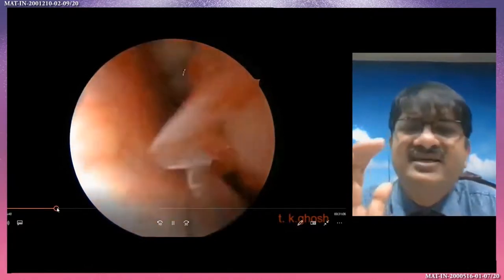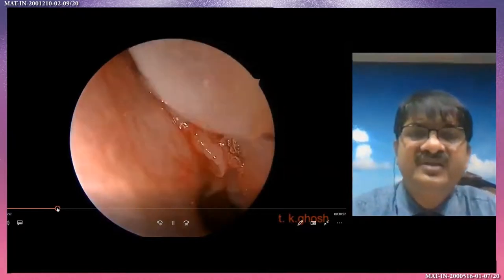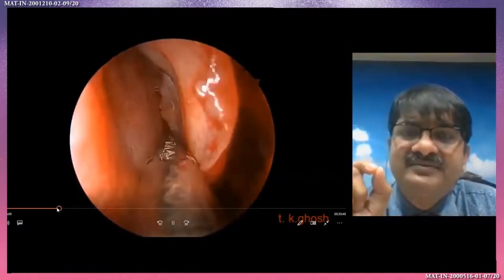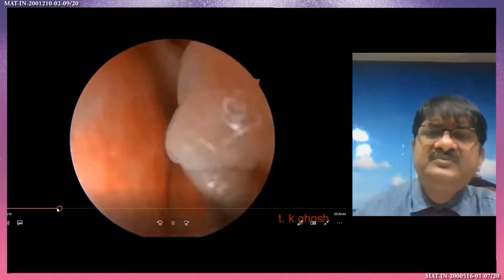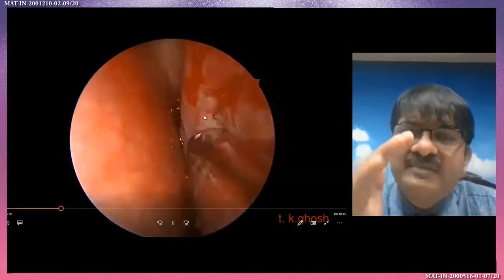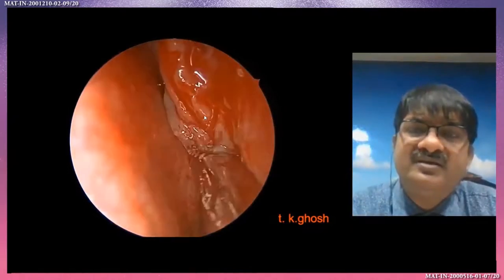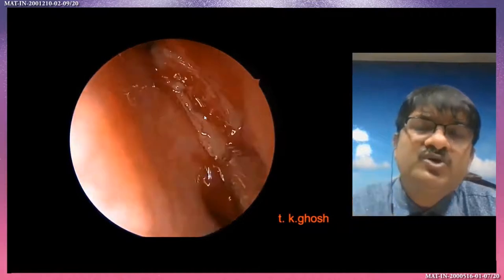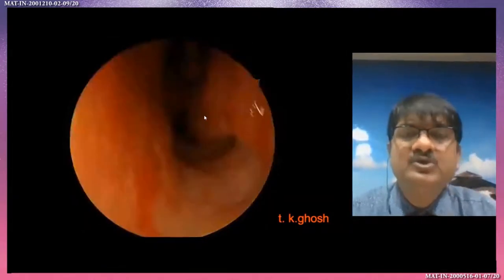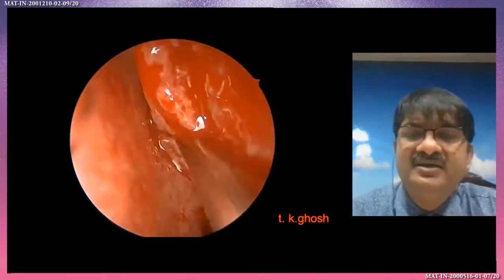Because here there is less chance of injury to any important structure. Look here — medially the septum, laterally the middle turbinate, and also just identify the superior turbinate. Here I am removing the part of the polyp and identifying the superior turbinate just lateral to the septum. Medial to the superior turbinate and lateral to the septum, you will see the sphenoid ostium — so confirm the sphenoid ostium from here to prevent any injury to the deep and important structures.